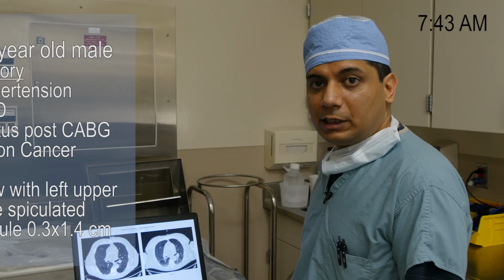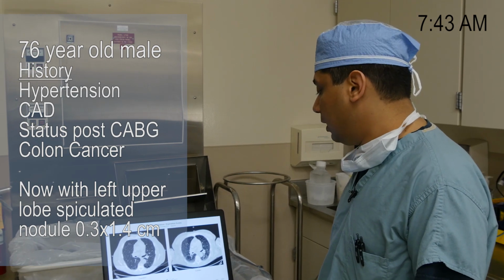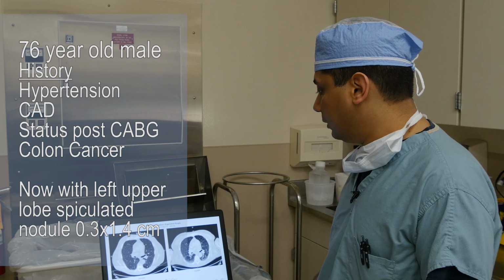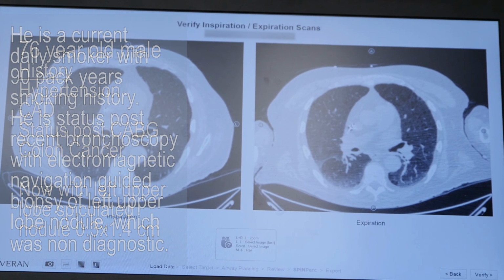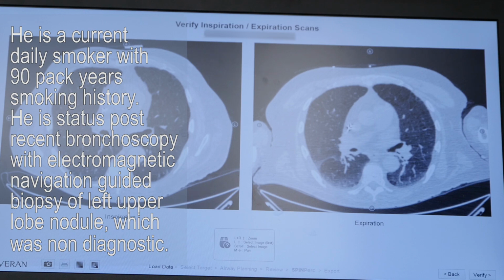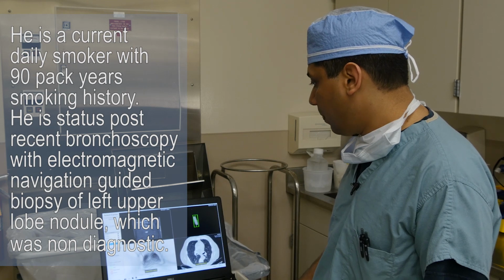This patient had a pre-procedure CT scan, as we do with all of these navigational procedures. This has 2 scans, inspiration and expiration scans. The first screen, we are confirming that this is an inspiratory scan. The arms are up by the head, and on the expiration scan, we can see the arms are down. So that seems good here. So I'll verify this, and we move on.